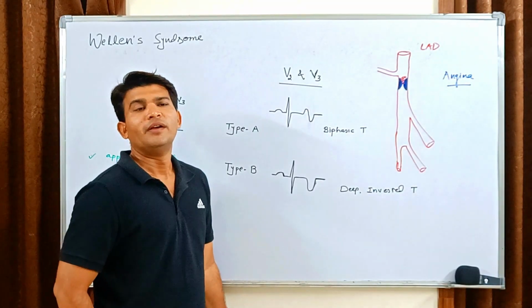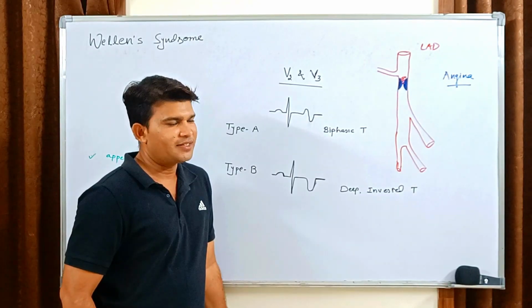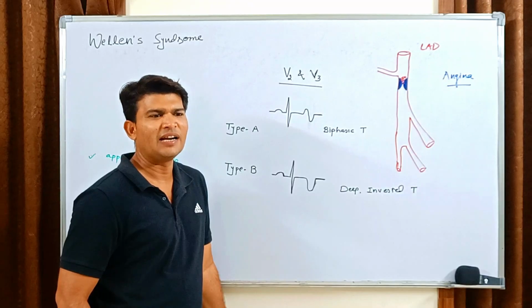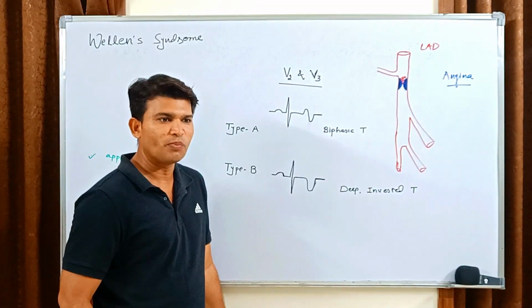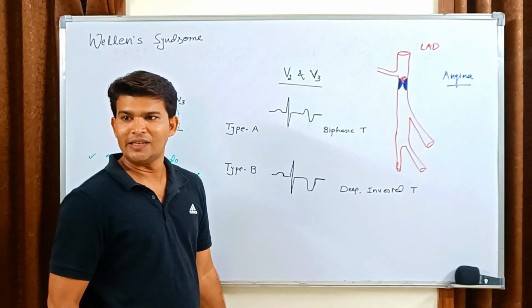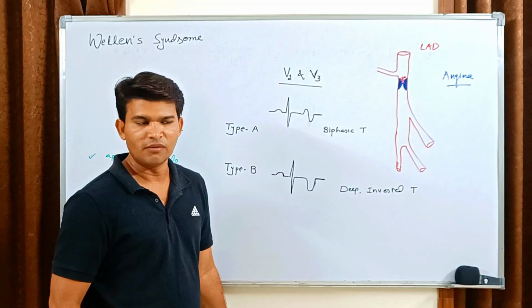Signs and symptoms, clinical judgment is more reliable, and according to the American Heart Association, there is a class of acute coronary syndrome patients who have a perfectly normal ST segment and T wave, right?